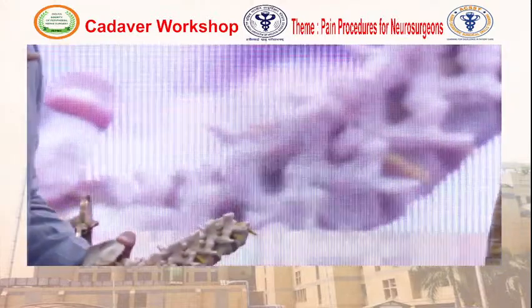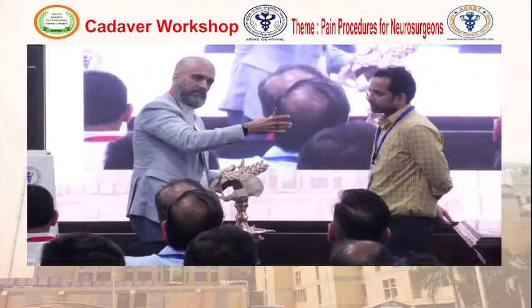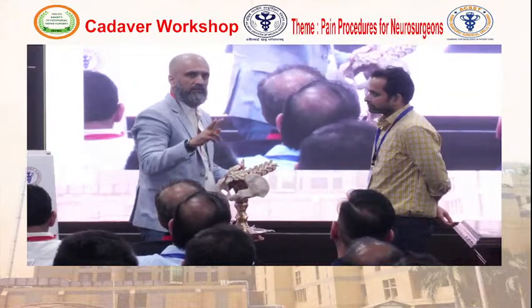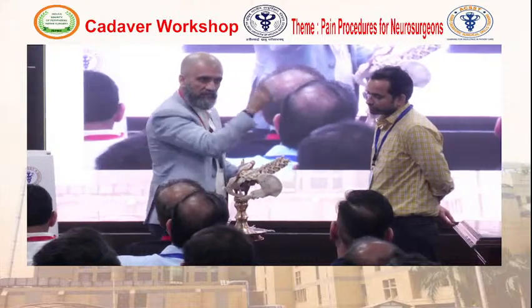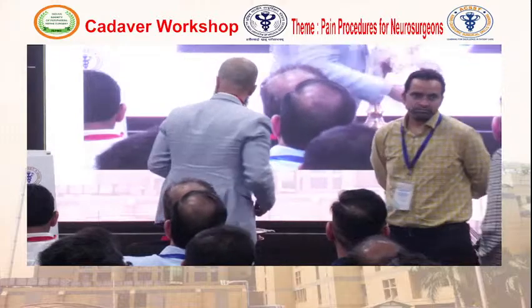But the concept is there because when we go through the cervical region, the direction is different, so the C-arm position will be different. But the basic concept of aligning the foramen with the C-arm remains the same. Clear? Thank you so much.